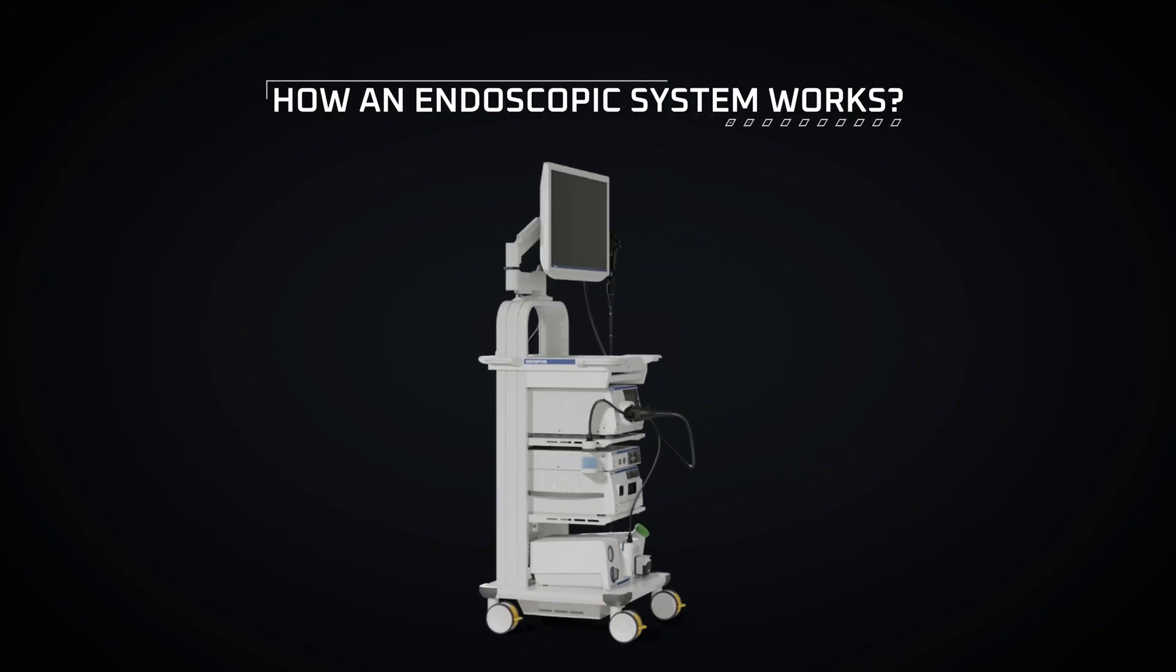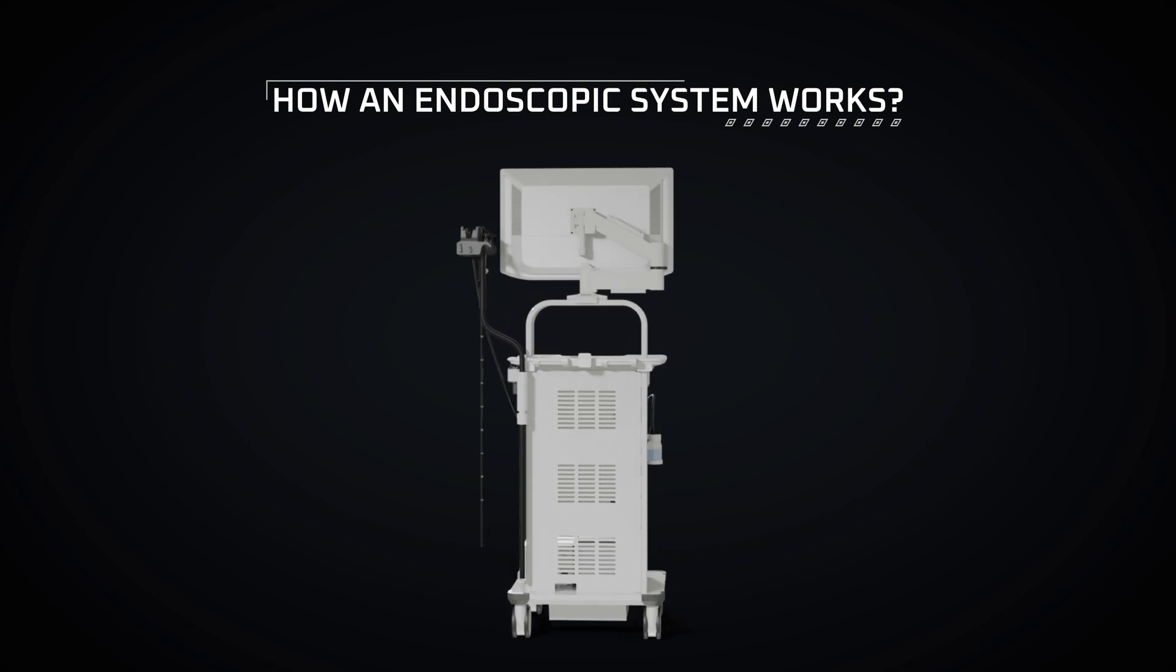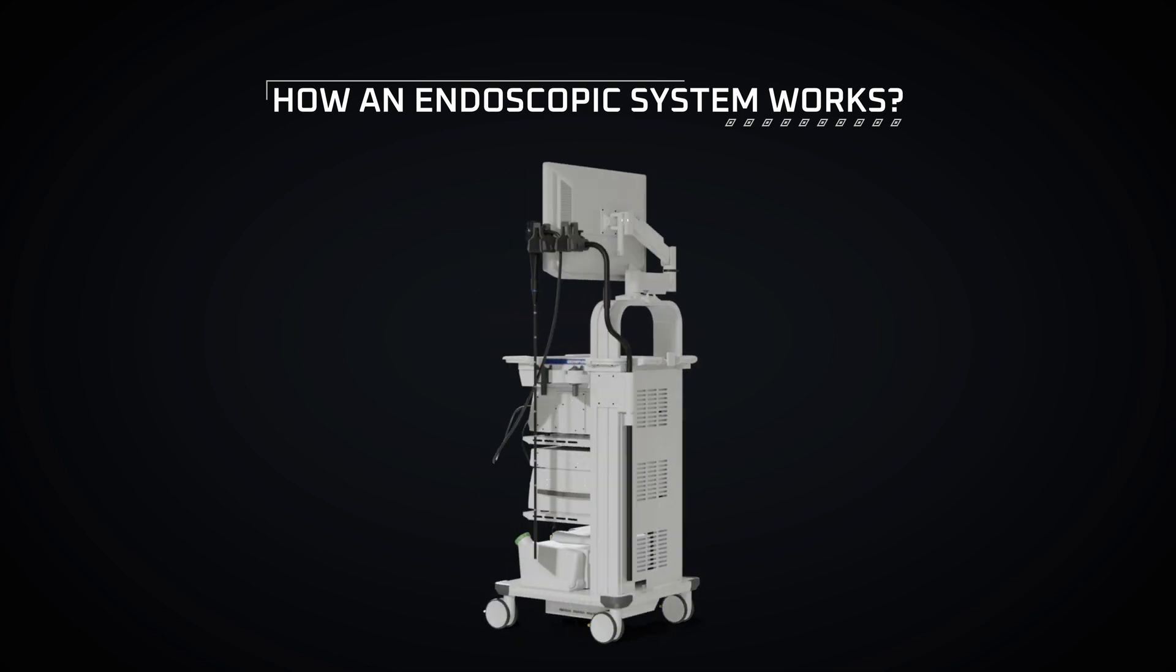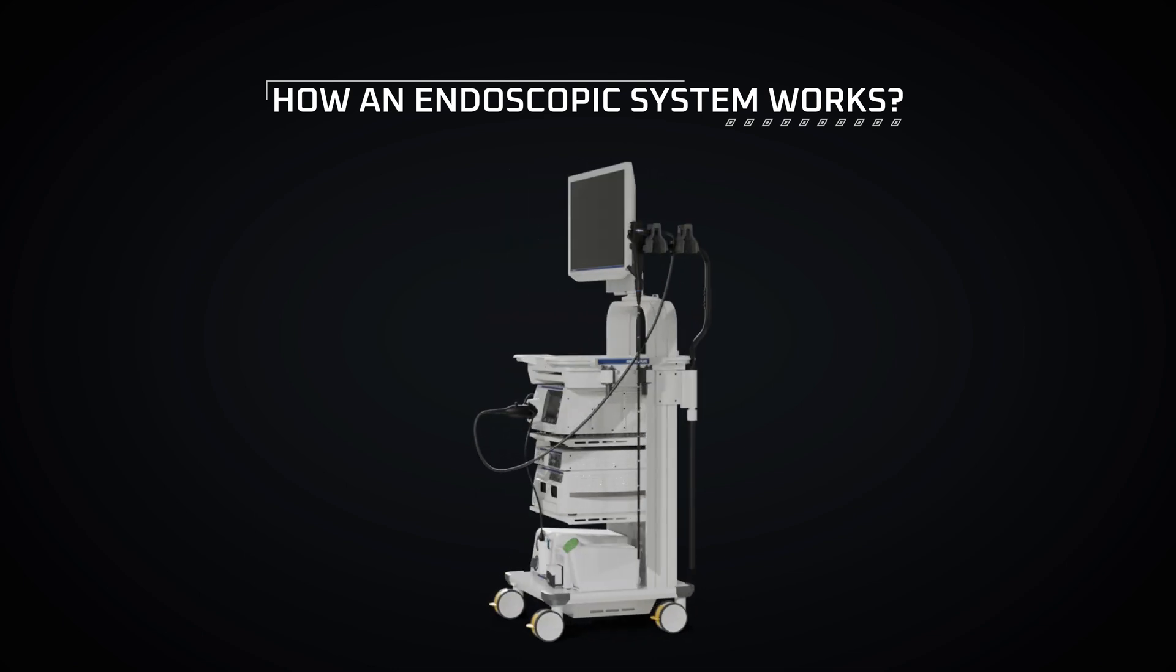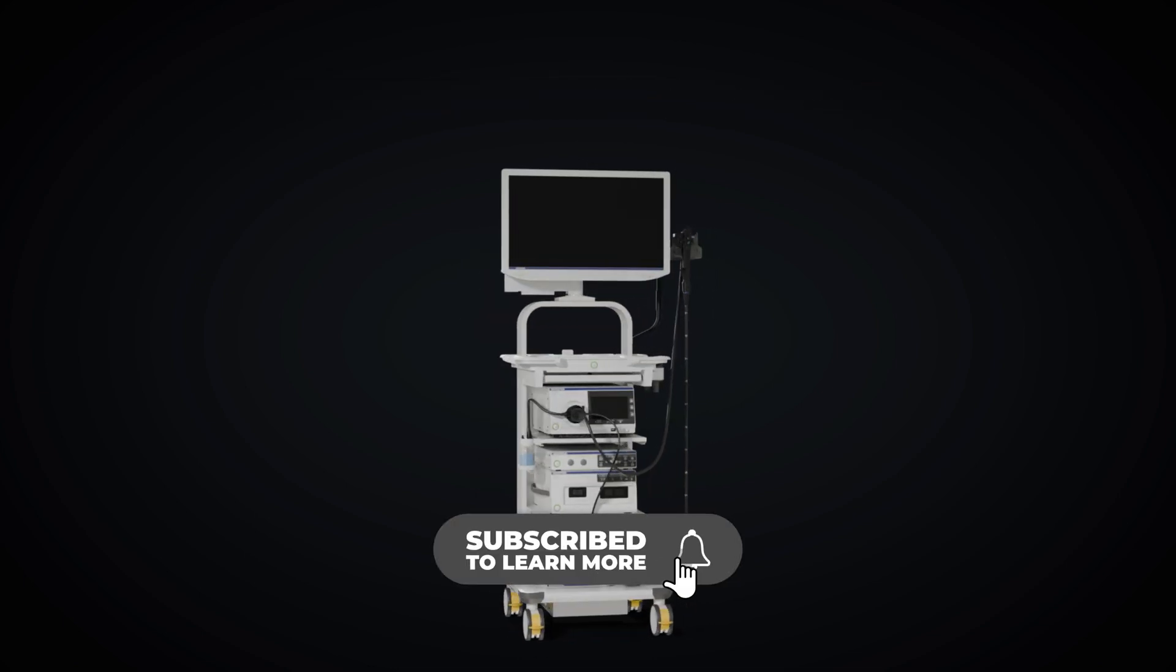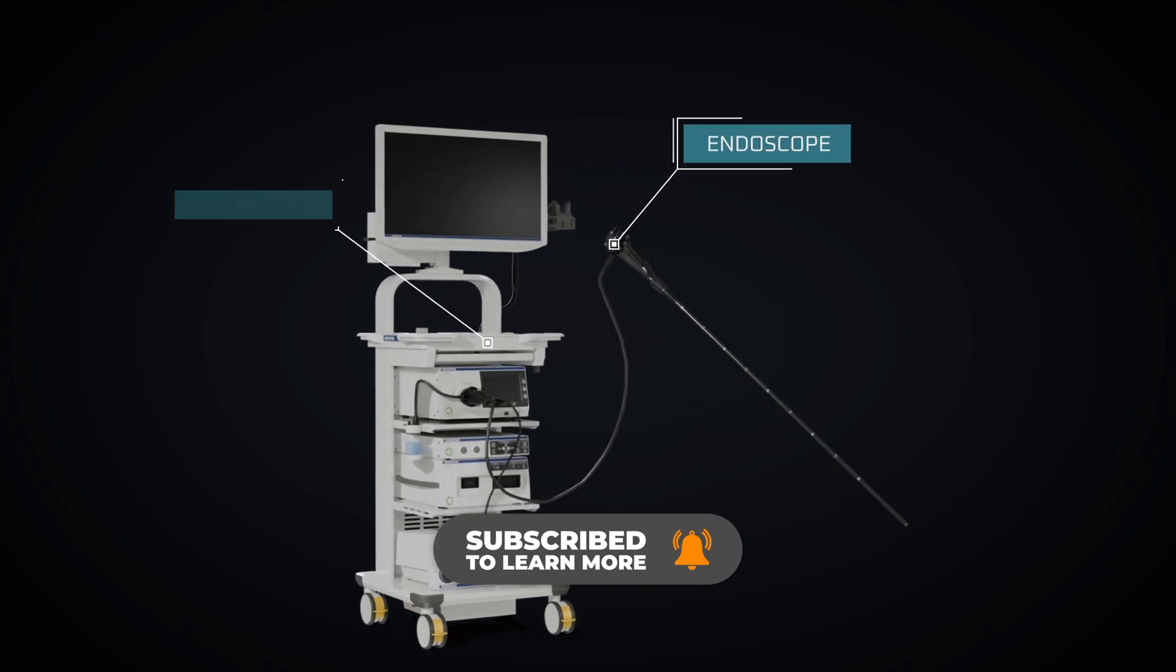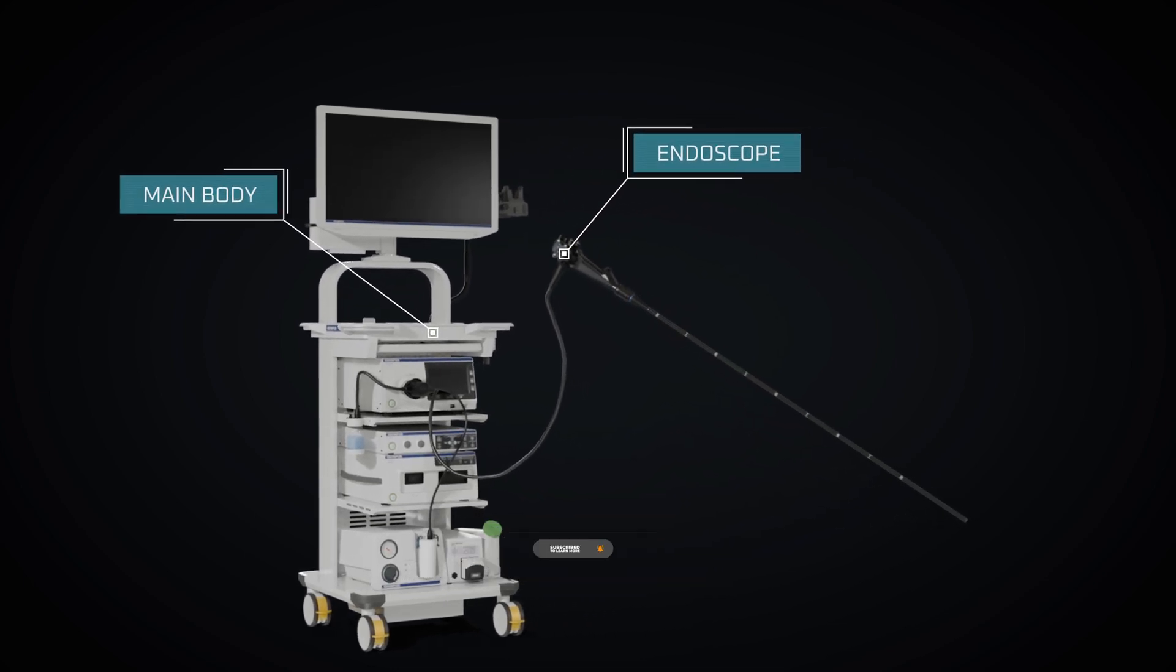Endoscopic system is a medical device designed for visualizing and accessing internal structures of the human body. This system consists of the endoscope and the main body.